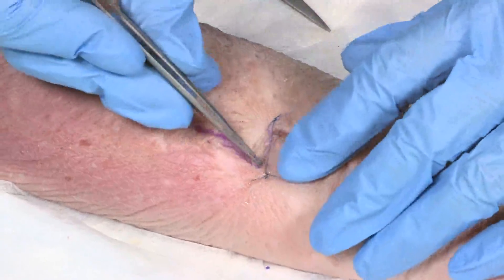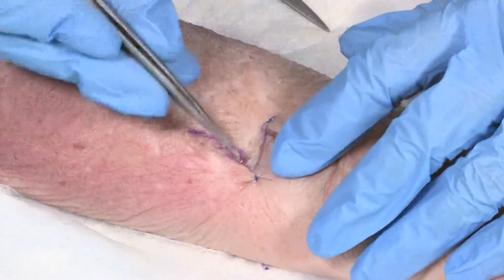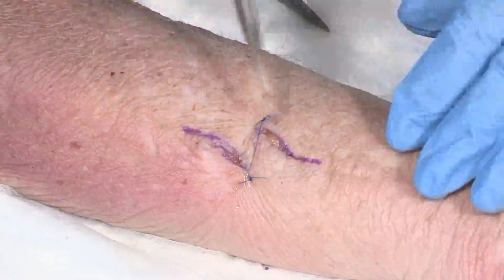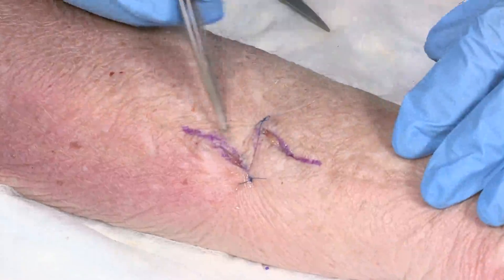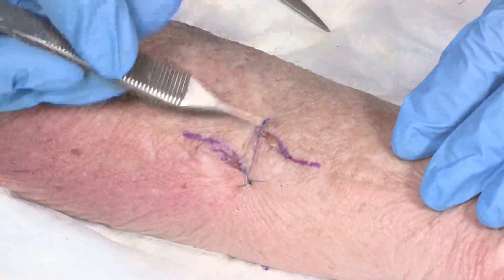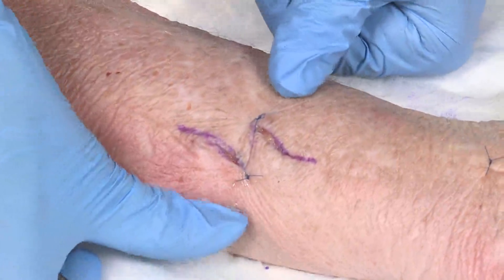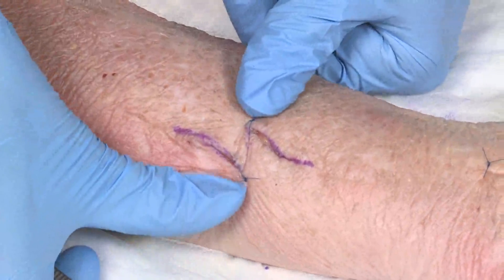As you can see on this cadaveric specimen, we've gained length along the central limb of the original Z by drawing in the tissue perpendicular to it.